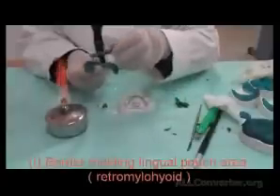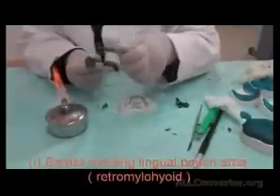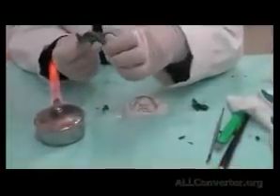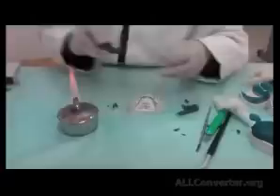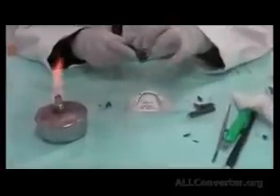So lingual pouch area, I add green stick. So the first layer is a glue. If it stops sticking, I stop adding. I add a bulk to the material. Heat it, manipulate it by my fingers, gathering the material together, making sure nothing goes to the fitting surface.